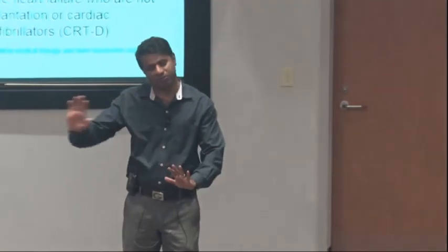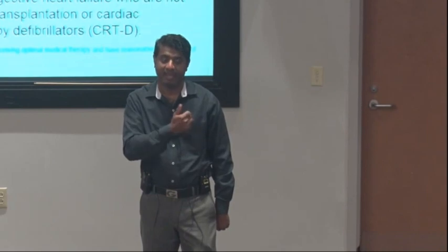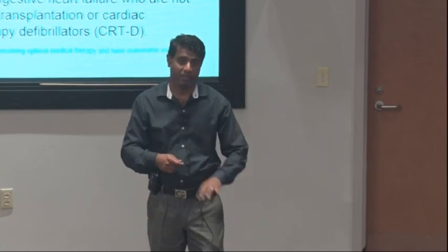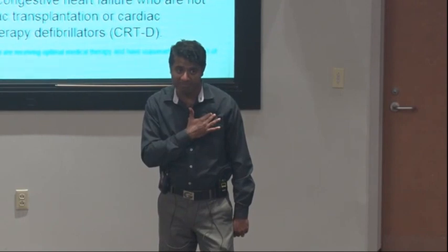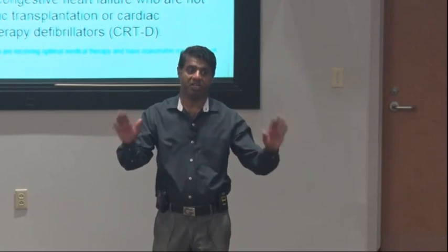Another internist question that you should know, not clinical. So if you have a pacemaker and pacemaker infection, some common guidelines. If you have a stitch infection, where they put the stitch, or if you have a skin infection, and you don't think it is in the pocket, you're okay to start antibiotics. You can still call EP. But if you think the infection is in the pocket, everything comes out. If the wires are settled for 10 years, you actually have to do laser lead extraction. Another rule is if you can see the device, for some reason the device eroded, and there's no signs of infection, that is infection.